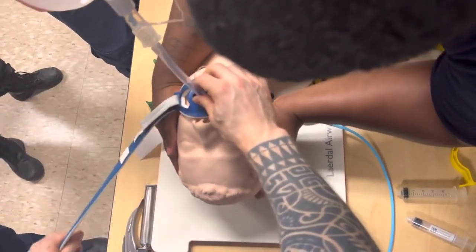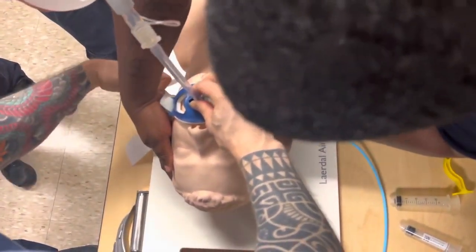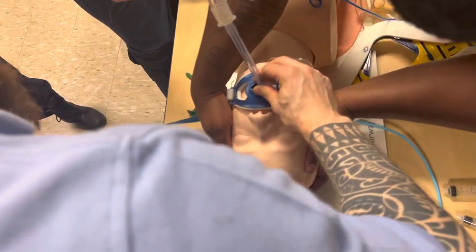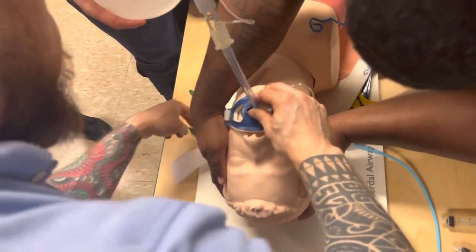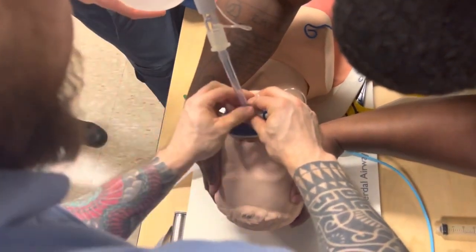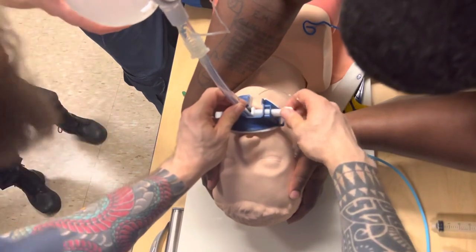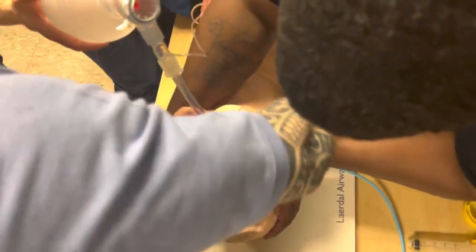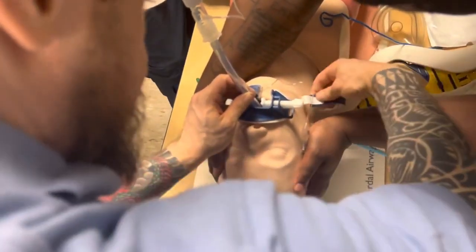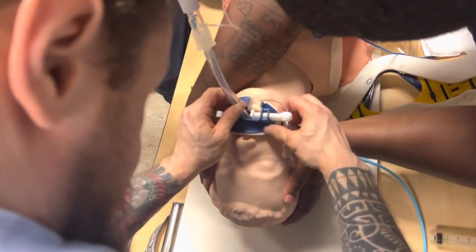So the bite block is there. We're going to put this behind his neck. And don't do this first. We want to get the Velcro going, because if I do this and then I start to adjust the Velcro, I'm going to have problems, right? I may pull it to the left or to the right. So the Velcro is the first thing to be secured. That's going to be behind the C-collar? Yep.